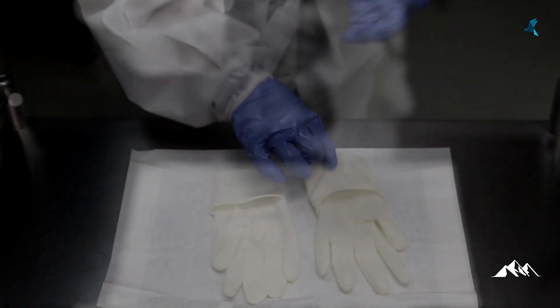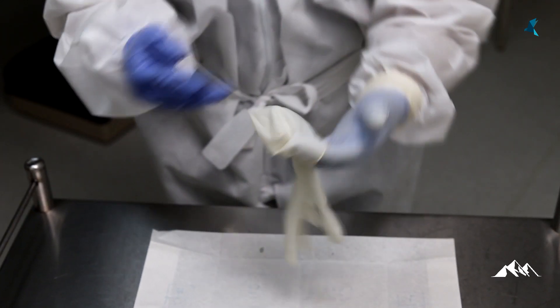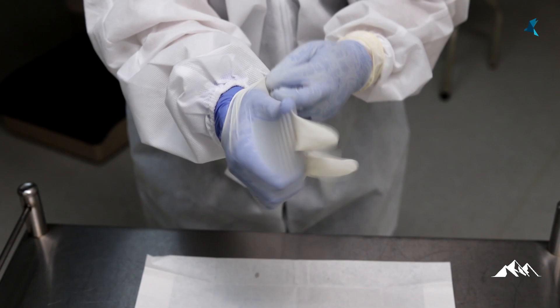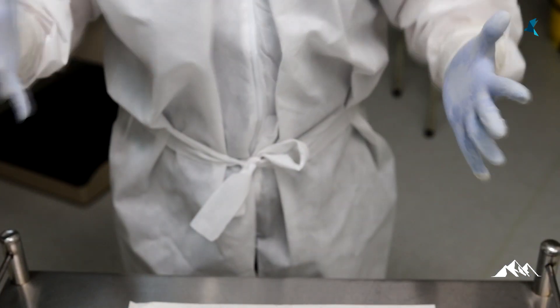Step 9: donning the second glove. This last step is performed the same way as how the first glove was put on. As we have put on the mask and goggles earlier, hands need to be sterilized using an alcohol-based hand rub — follow the 7-step hand hygiene. Extra care is taken here to make sure that the gloves are worn up to the level of the forearm and above the sleeves of the gown.